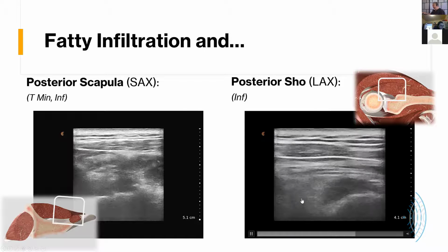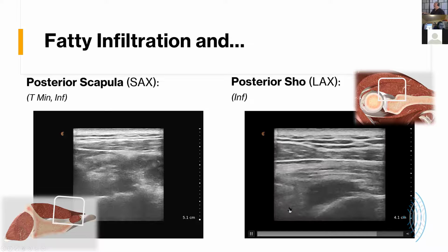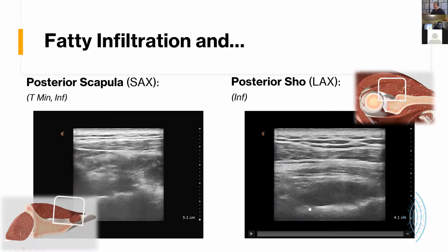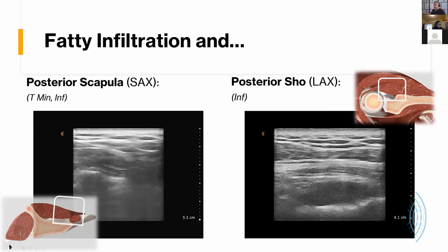Here we'll come past the glenoid. Glenoid is right over here. The material under the infraspinatus is all a fluid-based cyst, and that cyst is pressing up on the spinoglenoid notch, which is compressing the suprascapular nerve, and it's bringing about fibrotic infiltration of fat into the infraspinatus. This patient was just last week, and it was a physical therapist who identified this particular patient as simply having weakness in external rotation. And that's how it became on my schedule, and we were able to help identify the paralabral cyst in that case.